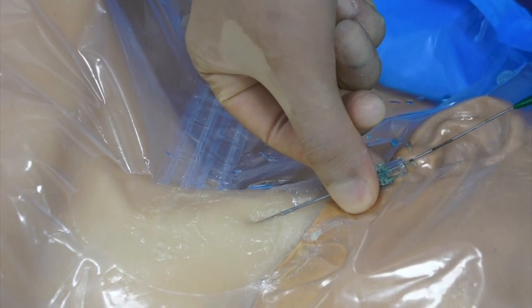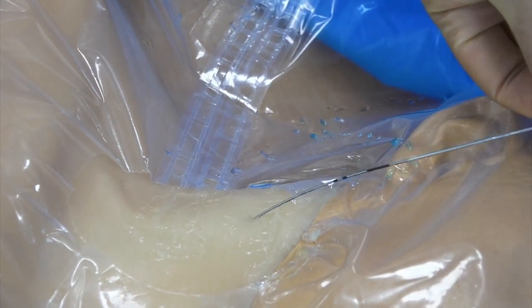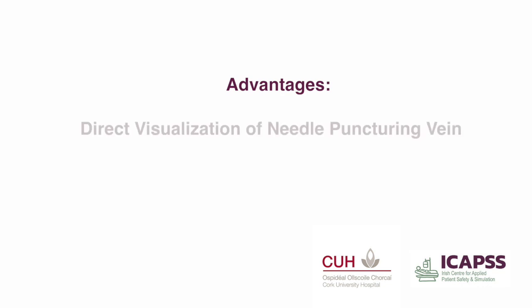If resistance is felt on the guide wire, rotating the needle may ameliorate the situation. The technique just discussed was the needle technique using a longitudinal ultrasound view. The main advantage of this technique is visualization of the entire needle as it punctures the internal jugular vein. However, with this technique there is a significant risk of misidentifying the common carotid artery as the internal jugular vein.